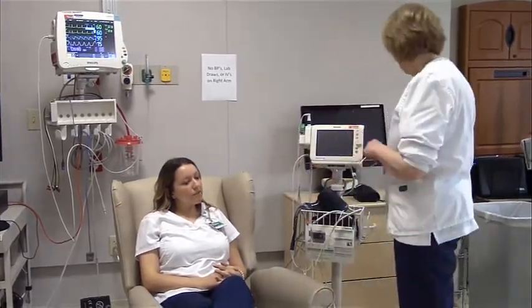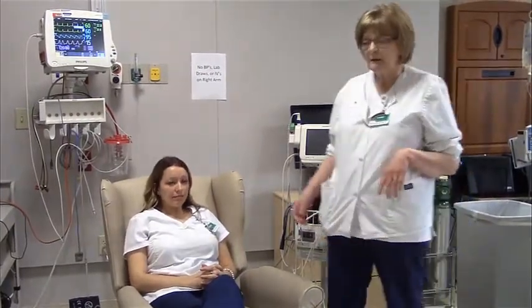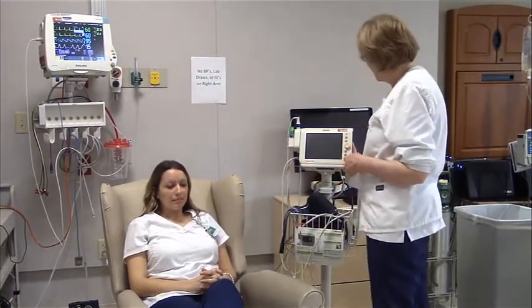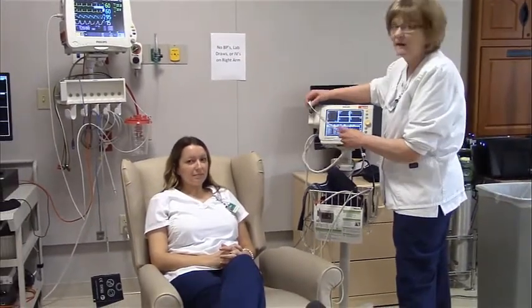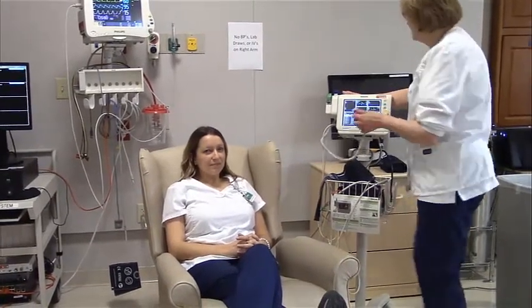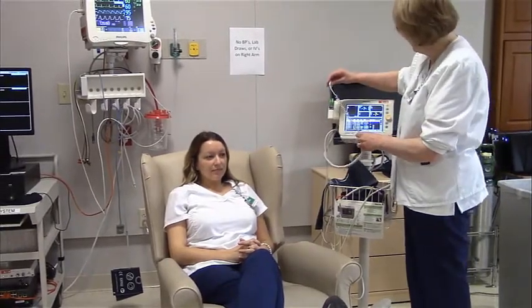The other thing I want to talk to you about are respirations. Okay? Respirations, you have to be a sneaky person to get these because the patient will pattern their respirations for you if they know you are taking it. So what I'm going to do is just turn on my little machine here. I am going to take the patient's temperature, but I'm also going to be looking at respirations. And what I'm looking for is the rise and fall of the patient's chest.